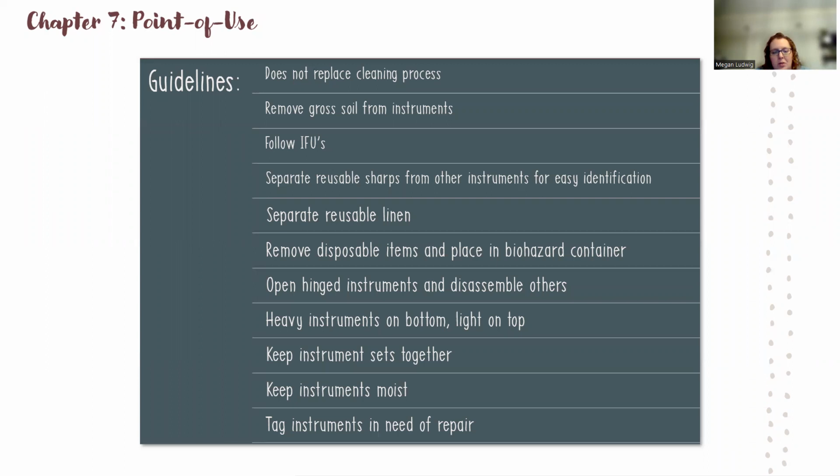Another important one is heavy instruments on the bottom and then put the lighter instruments on top, especially during transport until you're ready to start the decontamination process. Obviously, this is for prolonging the life of the instruments, making sure you don't damage those really delicate, fine instruments on the bottom by just throwing heavy stuff on top.